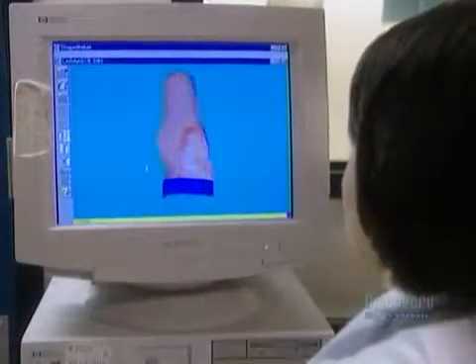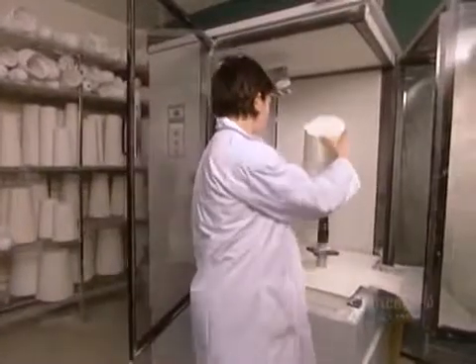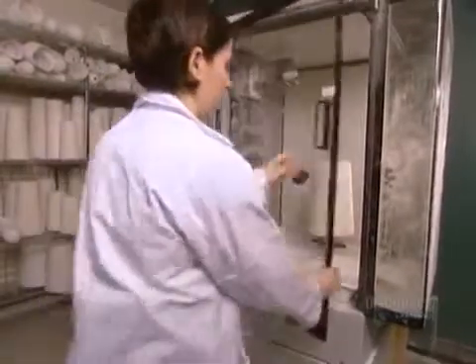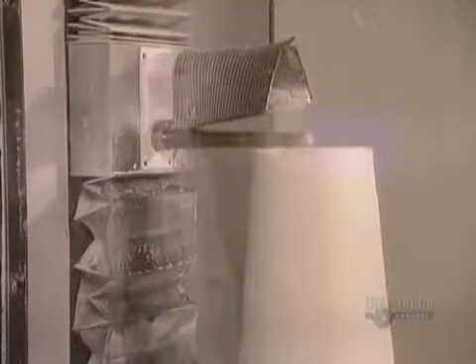A technician then makes any necessary modifications. They put a plaster block on a cutting machine, and the computer guides the blade to carve out the positive mold.